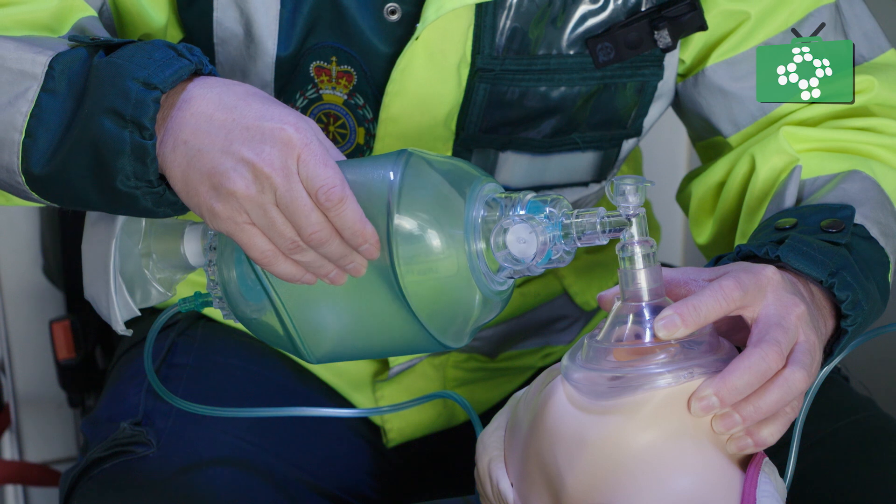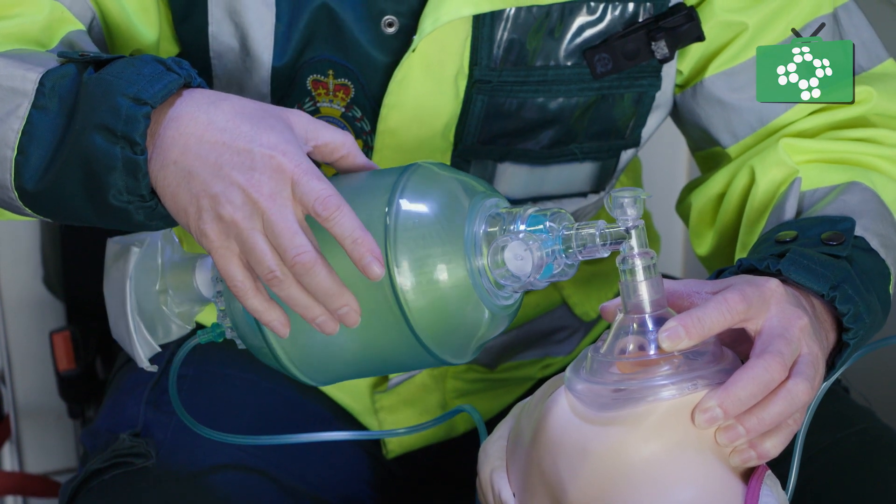And we can see rise and fall of the chest there, which confirms that air is going in and out of the lungs.